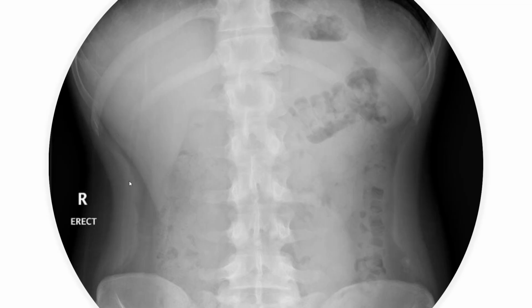So this is an example of somebody putting the marker in a correct space. We do have some air on the outside of the patient's soft tissue here, so they put a right-sided marker, and there are some markers that also just say which side, especially if you're using digital. So they wrote that this was the right side and that the patient was standing.